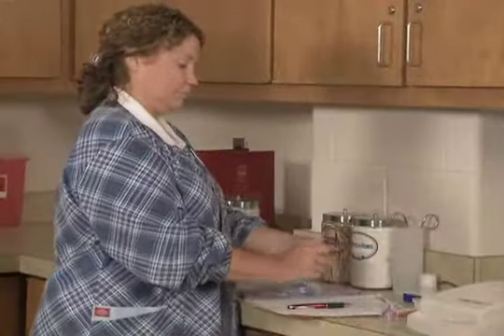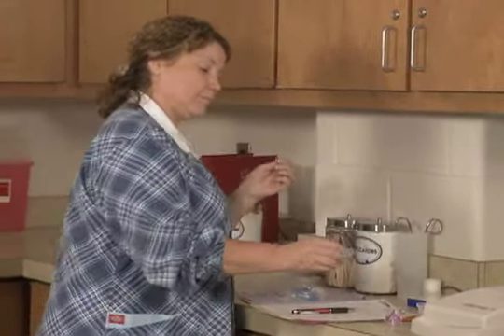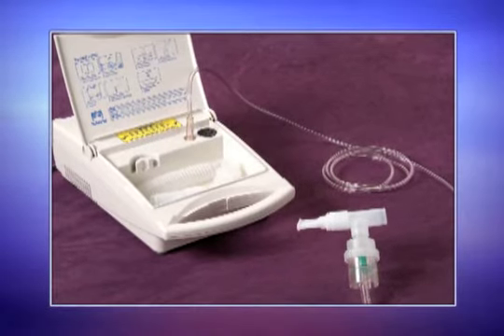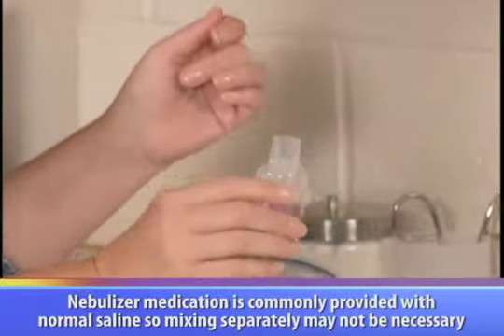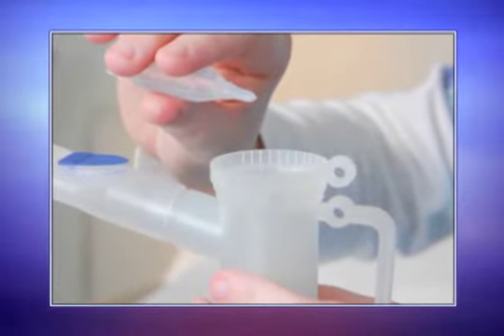Remove the nebulizer treatment cup from the setup and add the exact amount of medication ordered by the physician. The physician bases the amount of bronchodilator on the age and weight of the patient. Next, add 2 to 3 milliliters of saline for inhalation therapy to the cup that contains the medication. The bronchodilator must be mixed with saline before being administered to the patient.